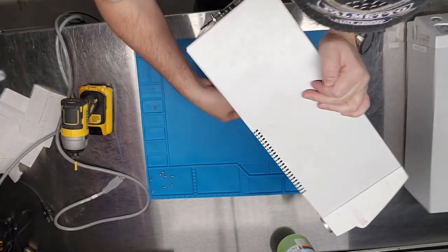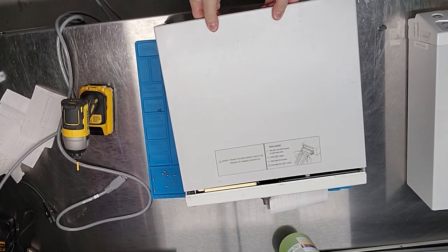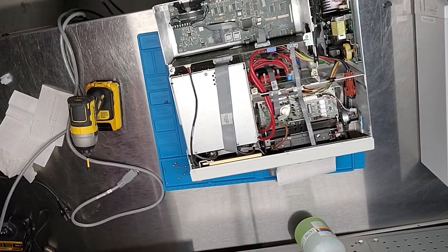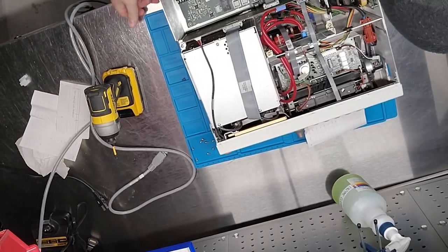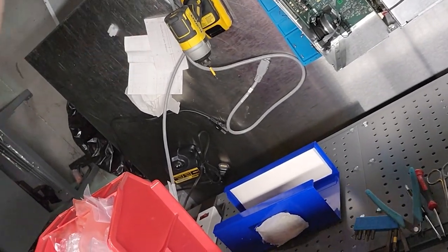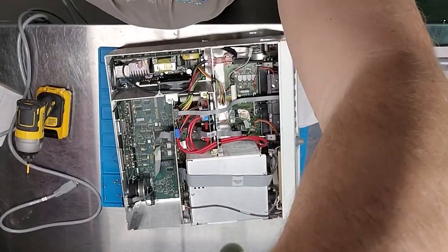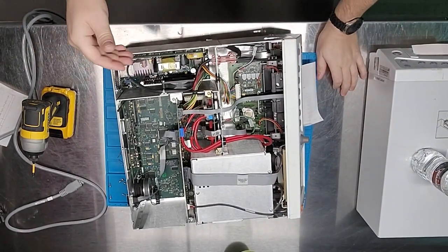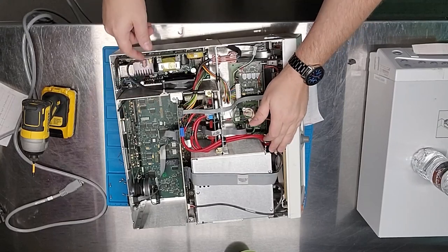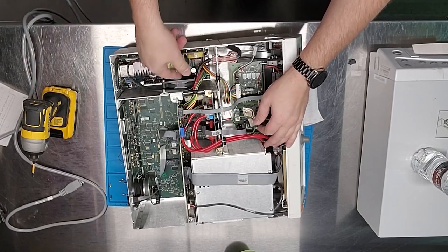Four screws on the bottom, five on the back, and the cover is ready to come off — or maybe not, since it's been on there a while. These units do have active cooling. The reason a PM isn't just hooking it up to a simulator is because the fan is not on the back — you can't clean it without opening it up.